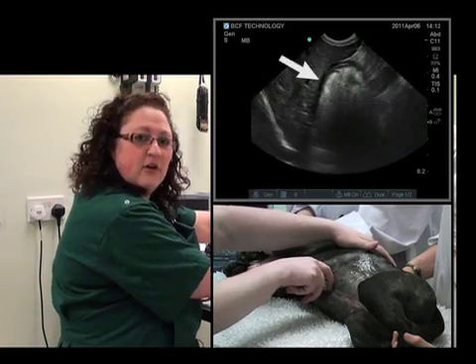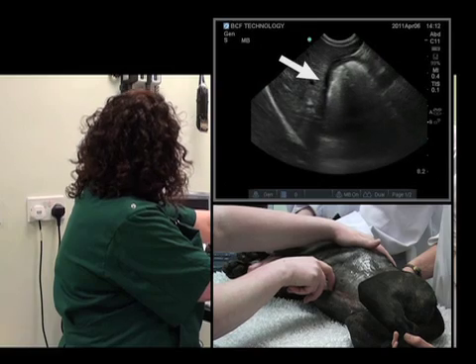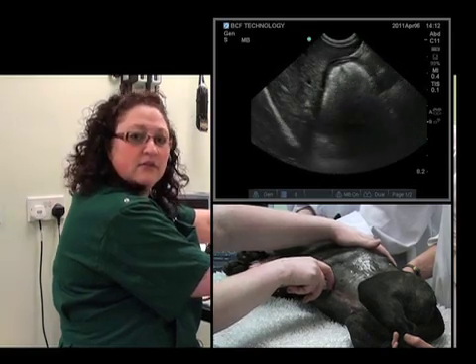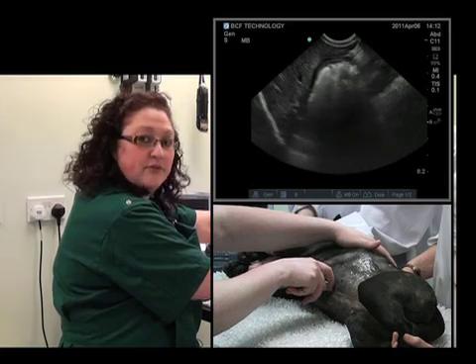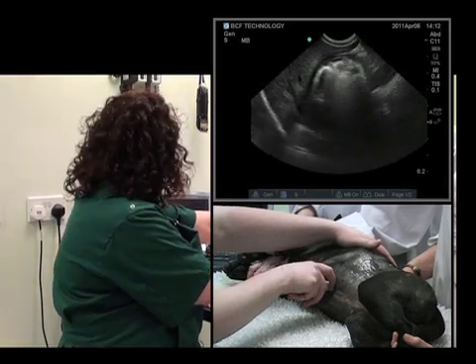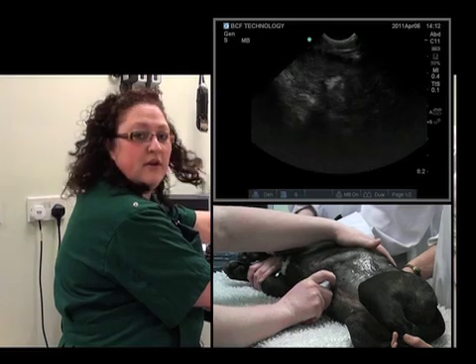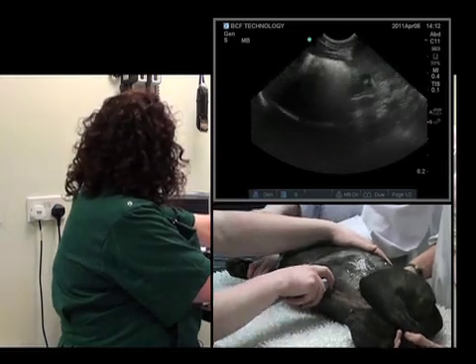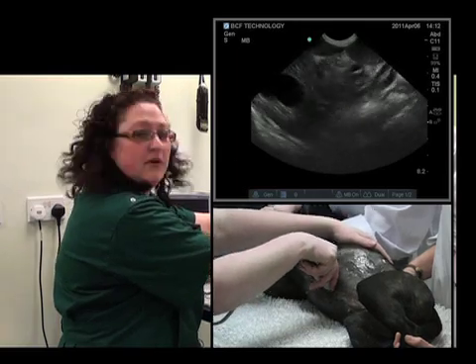And there's the stomach, just at the caudal border of the liver. So we'll evaluate the fundus down to the pylorus in the sagittal plane, and we'll do this with fanning — fanning up through the fundus and down through the pylorus.